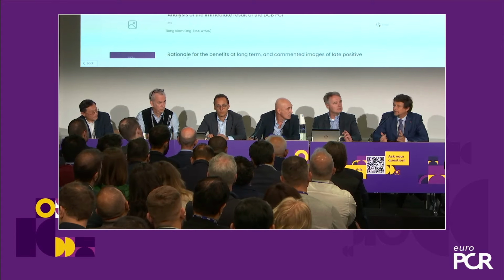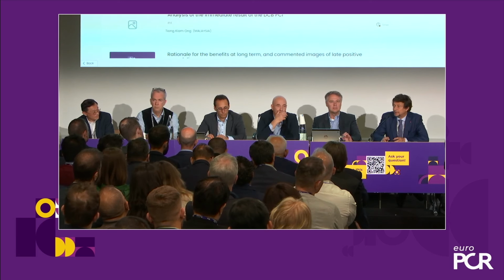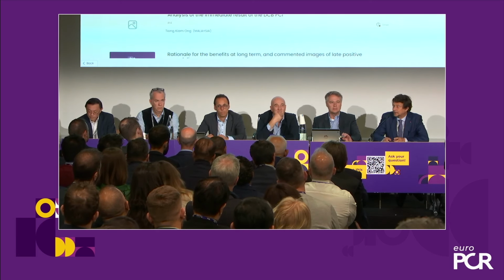We were involved in many studies, and the follow-up, even with the ultrasound and also the angiogram, was impressive. Why? Because there is a kind of remodeling, as we know, a kind of healing. Proper healing of the vessel. So even in diffuse disease in SFA, the long-term results are very often very good. This is something we can translate, with some small properties, to the coronaries. It's a great example because the risk of total occlusion in SFA is totally silent, but you get experience seeing these ugly dissections getting healed with time.